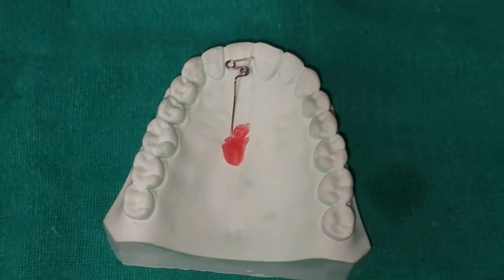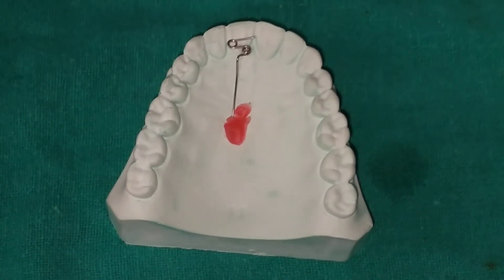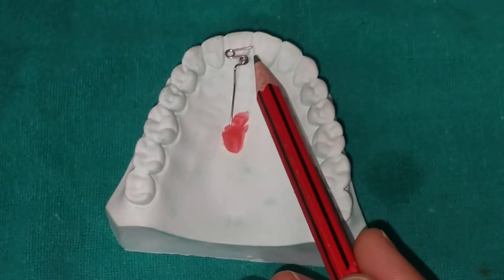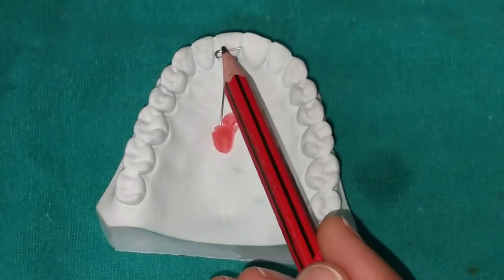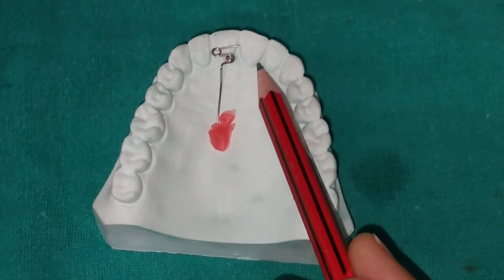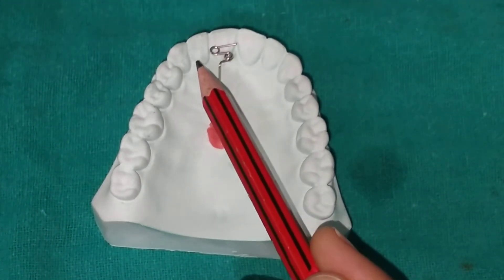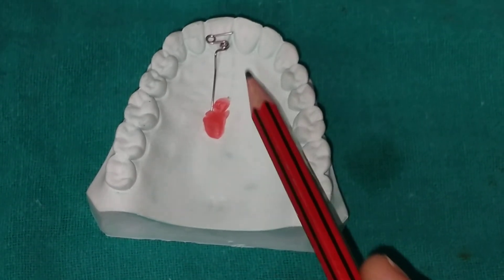The Z spring is a supported spring — it needs to be boxed in wax prior to acrylization. The Z spring is always covered by wax before acrylization, and after acrylization the spring is covered by acrylic. Since it is a supported spring, it is completely supported by the acrylic plate.